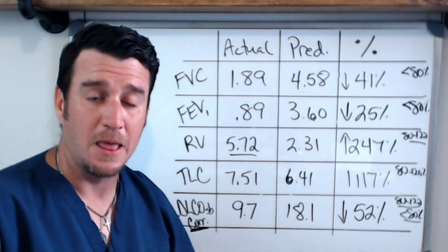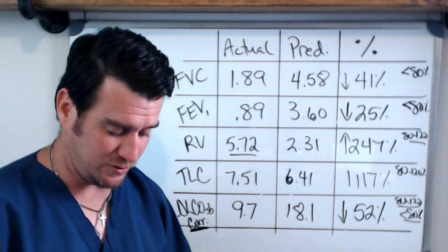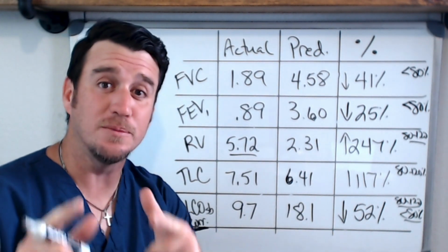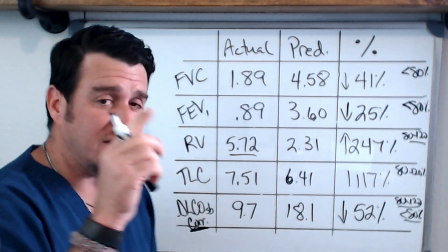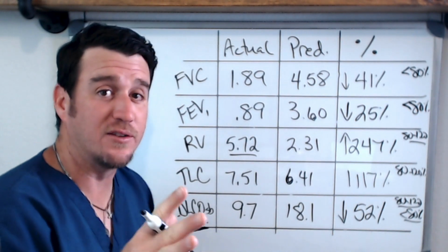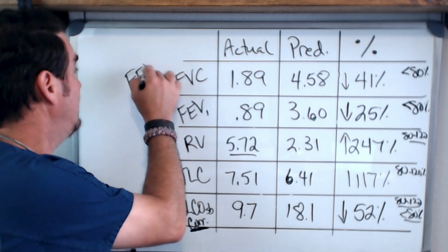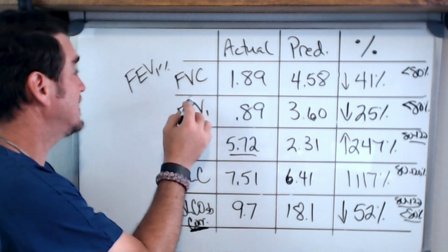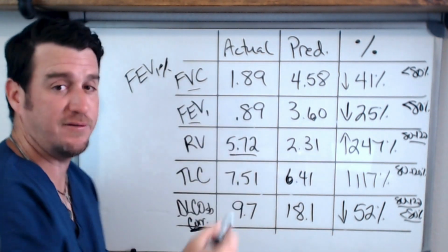Pause it now. When you unpause it, I'm going to go in and talk to you about what those 2 formulas were. So now that you're back, here's what we're talking about, okay? There's 2 formulas, and here they are, okay? You should have done the FEV1%, which is where you divide the FEV1 by the FVC.